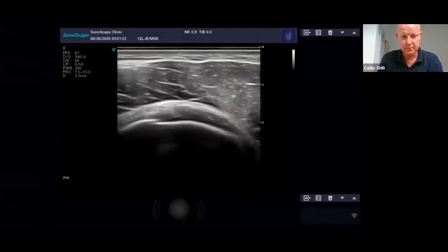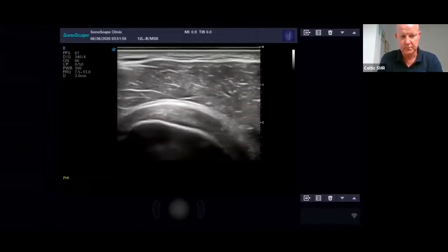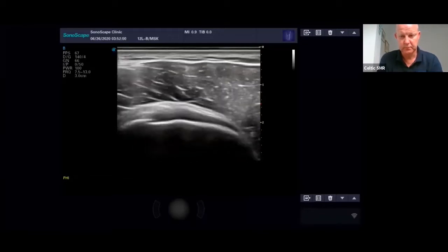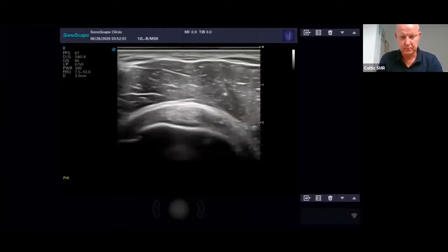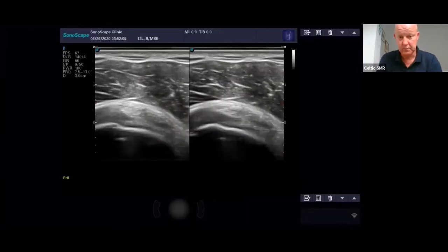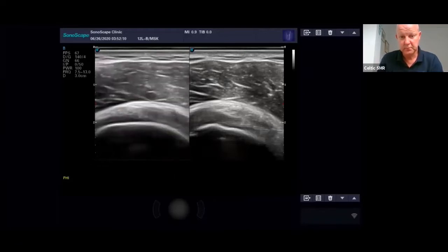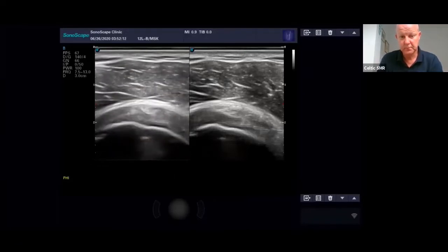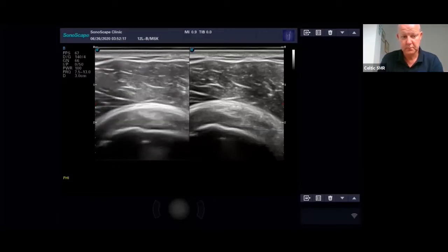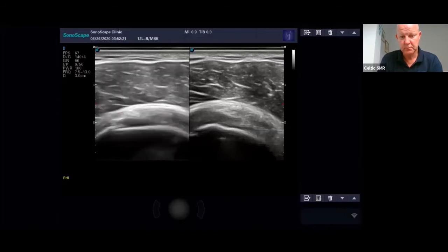the next time. So, would you have to compare the left shoulder scan with exactly the right shoulder scan to see? Yeah, exactly. If I thought it was a bit thickened, a bit tendinopathic, then I'd go over to the other shoulder. And you could probably do it on this screen. You can dual the screen. What's the average diameter? About 3 to 4 millimeters. Is most tendons in the body, I think, are. Yeah, but as I say, I tend to eyeball it and just compare it with the other side. And if it's different from the other side, then it's, you know, I'm on the same side here, by the way, but I'm just showing you an example.